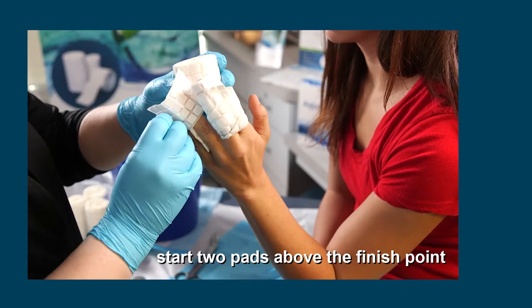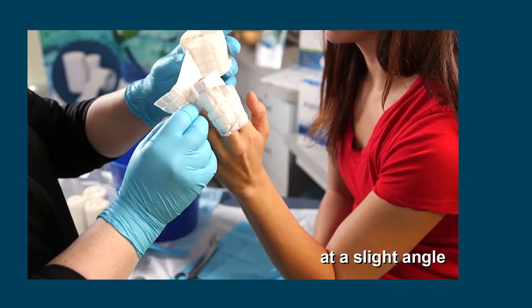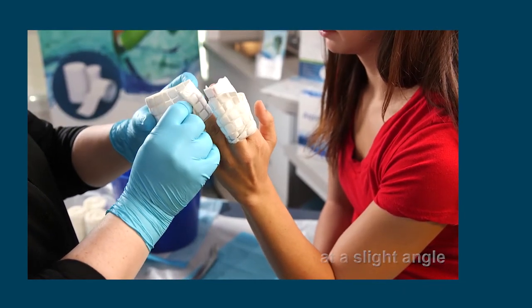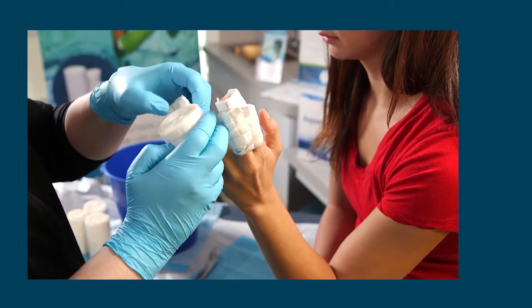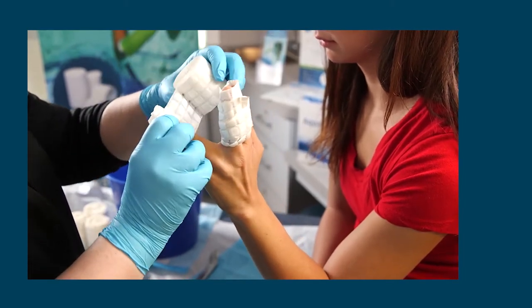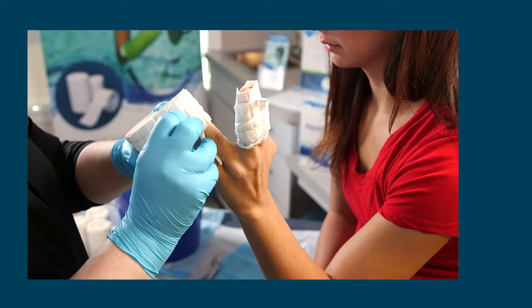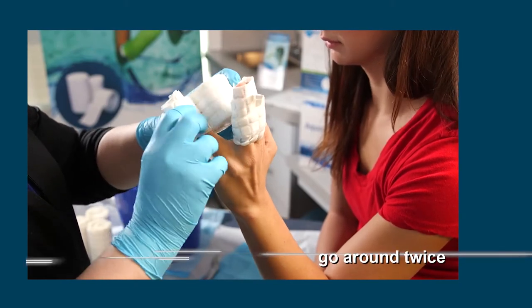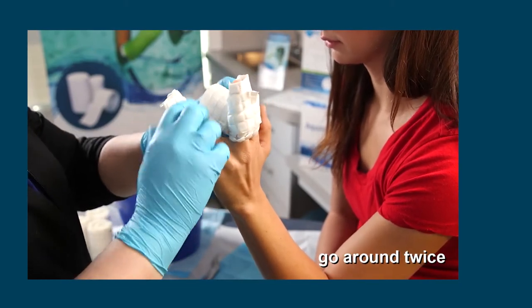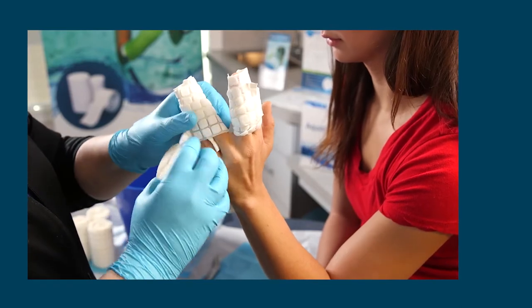Start two pads above the finish point and at a slight angle. Go around twice, then continue with 50-50 coverage.